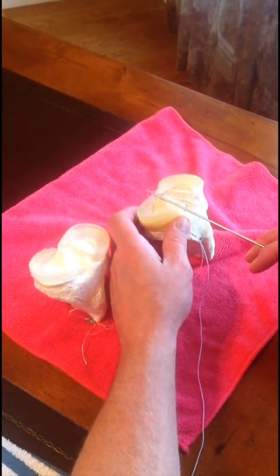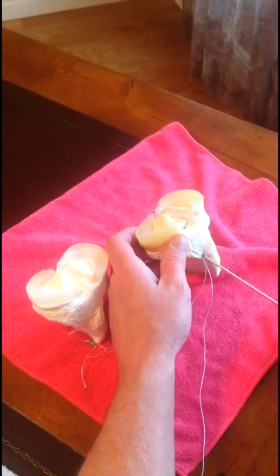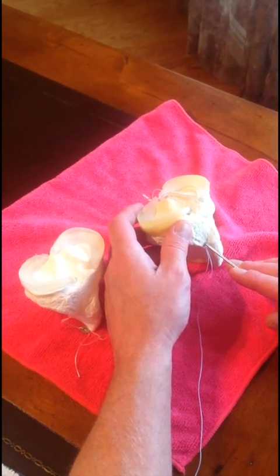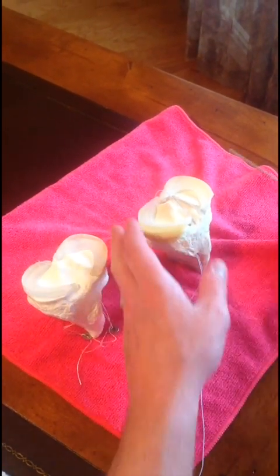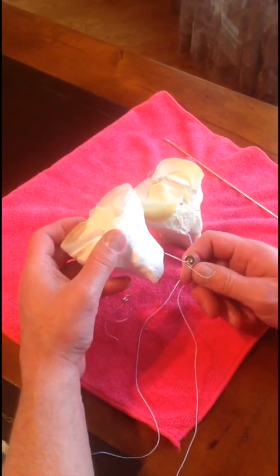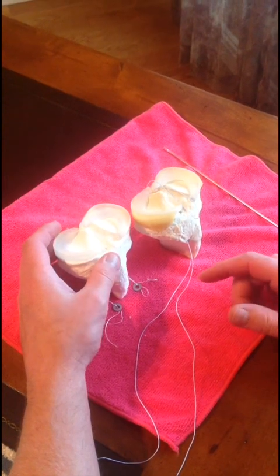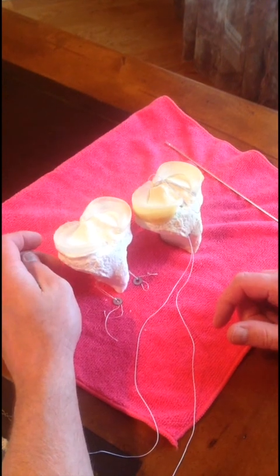You can see here I've got my medial entry point going into my medial root, and then I'll reach up and pass a couple of luggage tag sutures to allow me to get an anatomic root repair. Now if I've already placed my root repair tunnels and then drilled my ACL tunnel, I will place a spinal needle up with a suture shuttle so that if I happen to penetrate the graft or get alongside the graft, I avoid losing the suture by placing it first then trying to pull my graft up and through it.